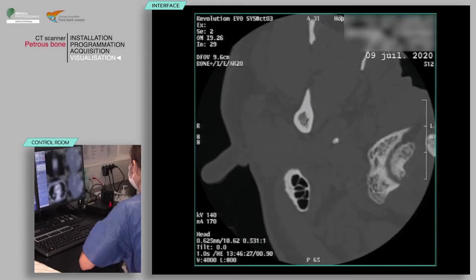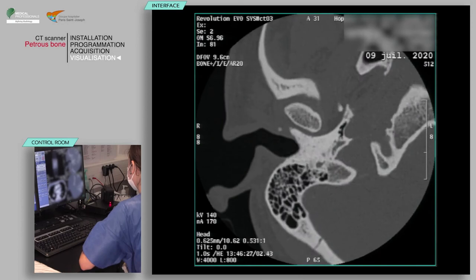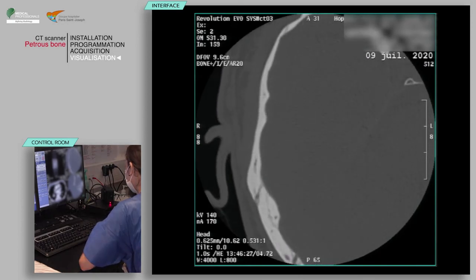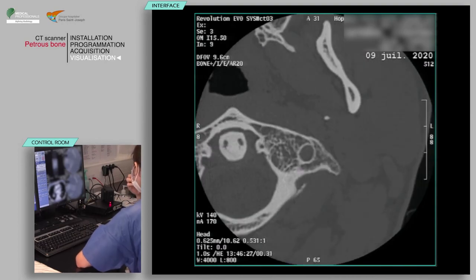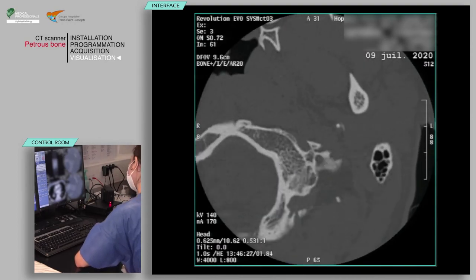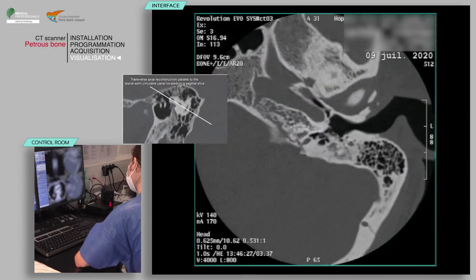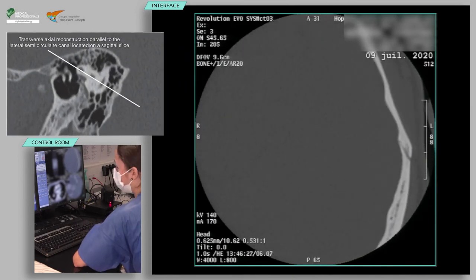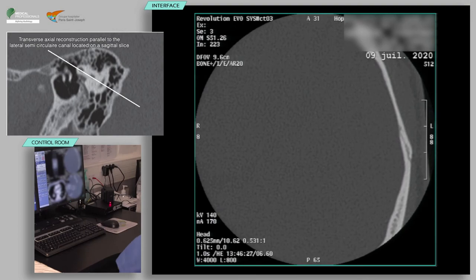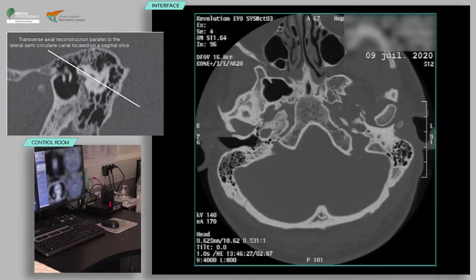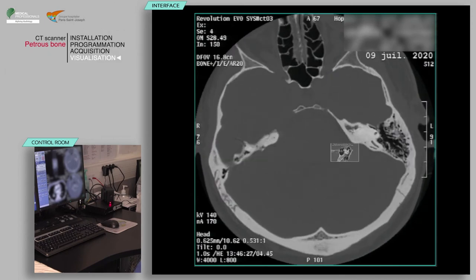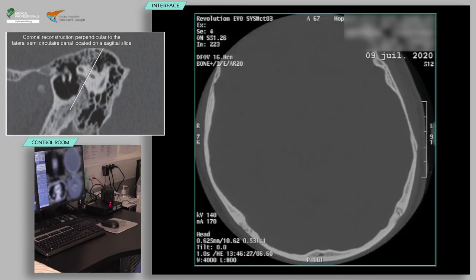Verify the absence of patient motion on the acquisition and that all pertinent anatomy is covered. You can perform a multi-planar reconstruction according to the planes requested by the radiologist. Radiologists frequently require a transverse axial reconstruction parallel to the lateral semicircular canal located on a sagittal slice, and a coronal reconstruction perpendicular to the lateral semicircular canal located on a sagittal slice.